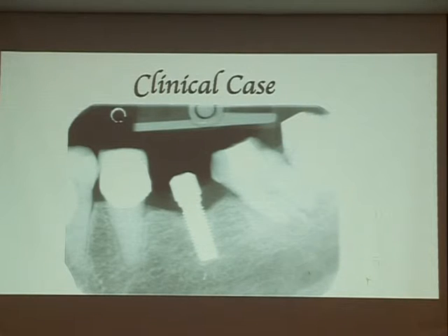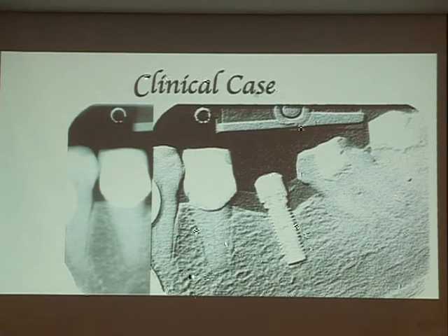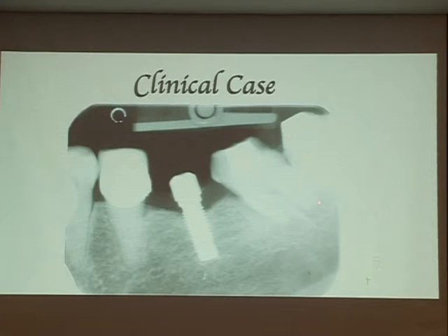I knew I was in trouble because there's a fractured instrument here. Okay, sorry about the resolution. My screen is much better. There was a fractured instrument I did not notice in the first appointment on consultation because I was busy, I'm tired, I was distracted by this implant. Okay, so that's my excuse.